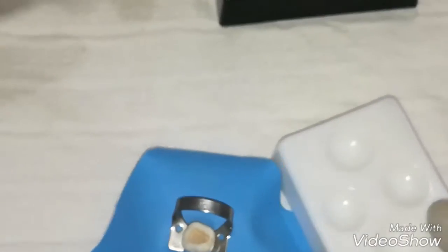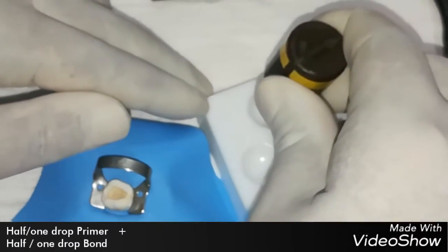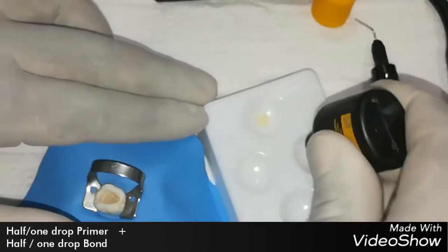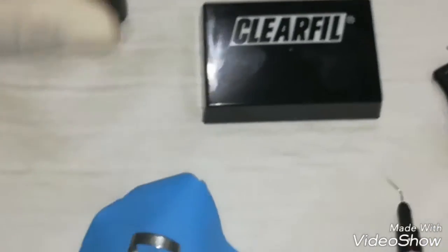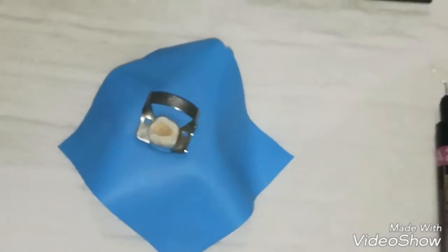In the dispenser, we drop a little bit — more or less one drop of primer. In another part, one drop of bond.